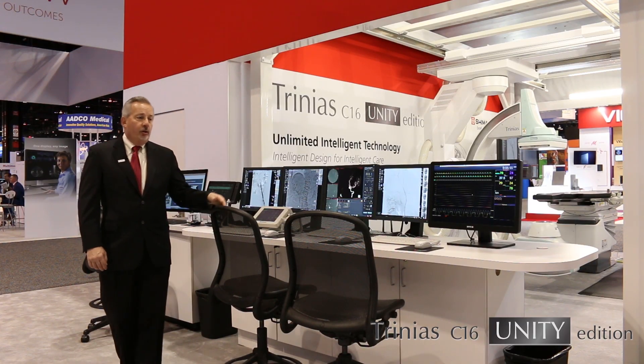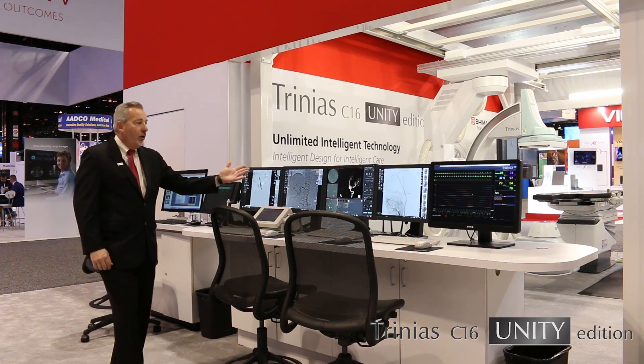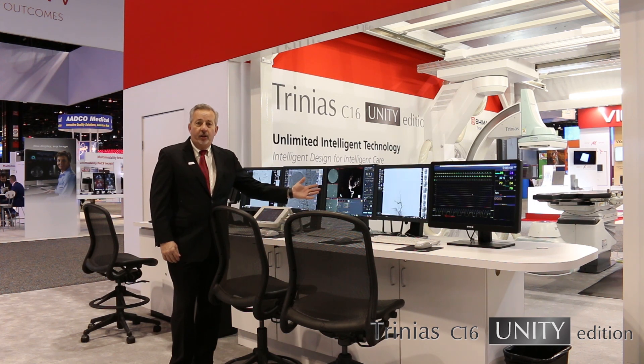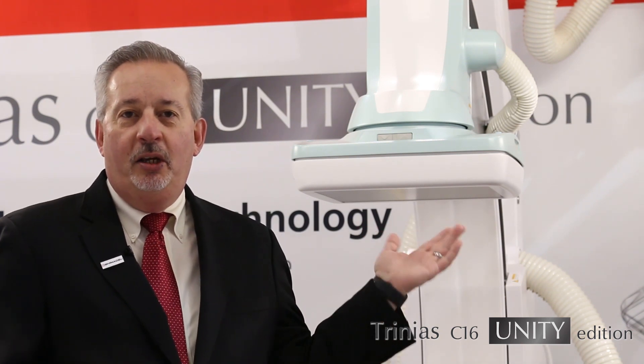The Trinius Unity features a control room setup — typically two monitors. One is the patient monitor, the second is the imaging monitor. Here you also see the 3D workstation, which is available as an option. At Shimatsu, the Trinius Unity Edition features a wide portfolio for flexibility and versatility to meet all of your needs. Behind me you see the Unity C16, but we also offer the 8-inch detector and 12-inch detector. We offer floor-mounted versions and ceiling-mounted versions, as well as monoplane and biplane versions. We believe this provides the versatility for any application in the marketplace.